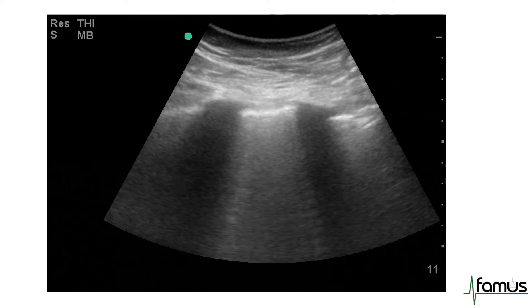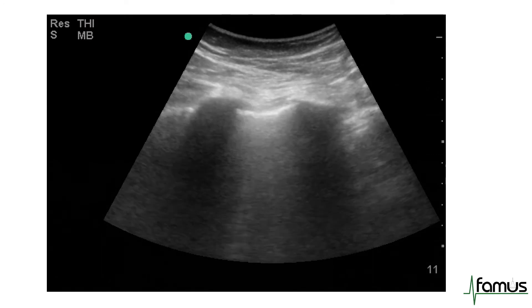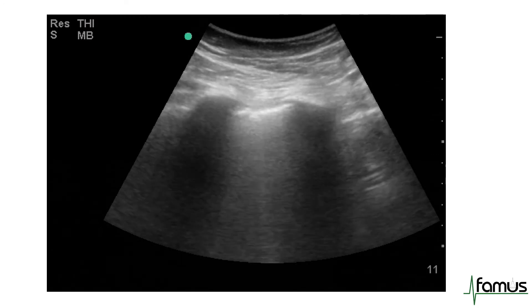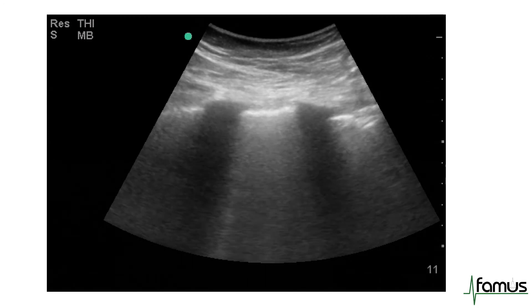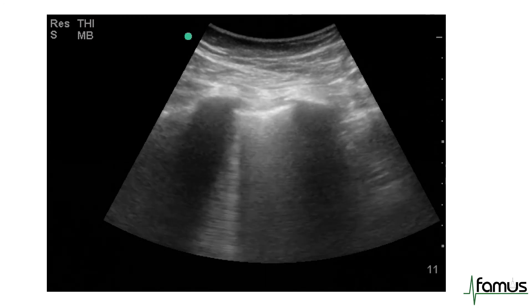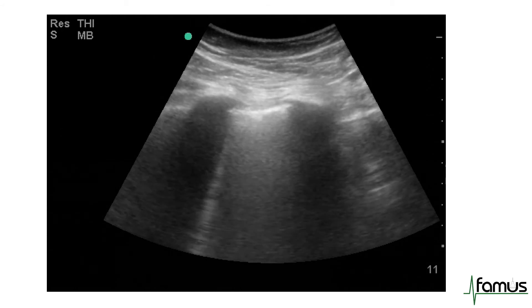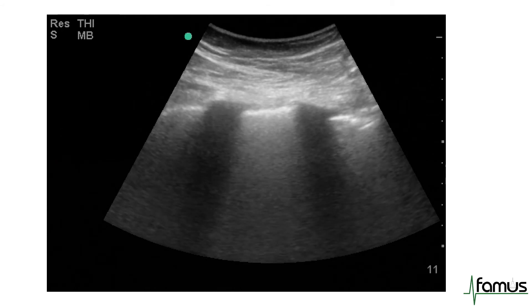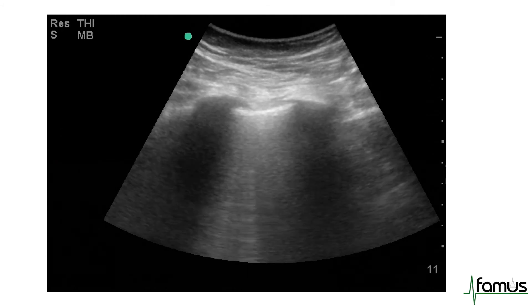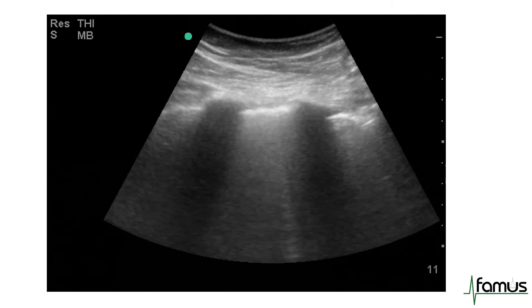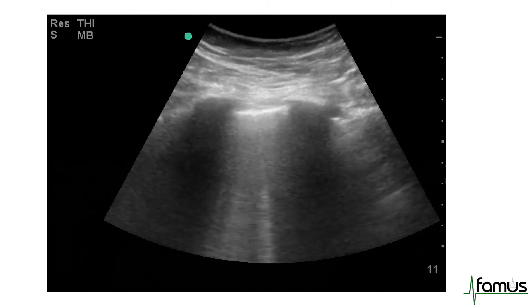I want to highlight another example of B lines, which you can see on this cine, with multiple vertical ring-down artefacts causing bright laser-like lines which move with respiration.